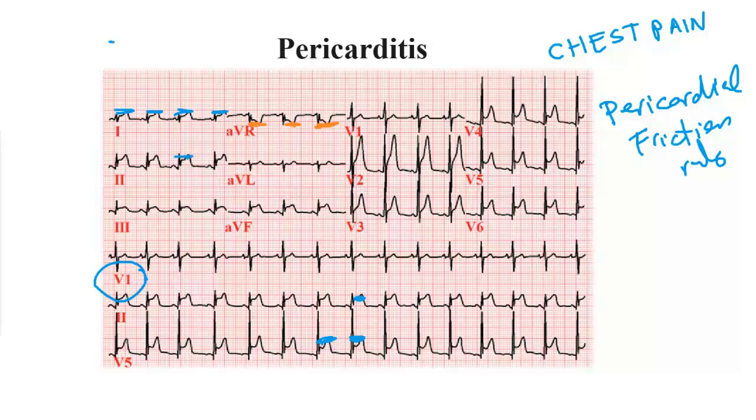Now let me ask you, what's the difference in the presentation of EKG for pericarditis versus STEMI? So first, could you tell me what STEMI stands for?